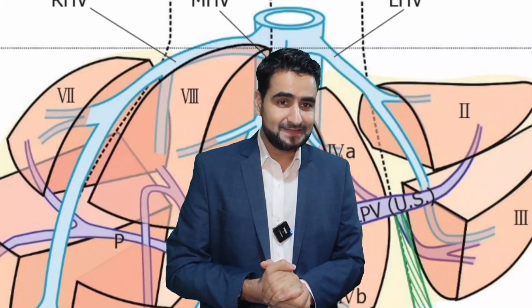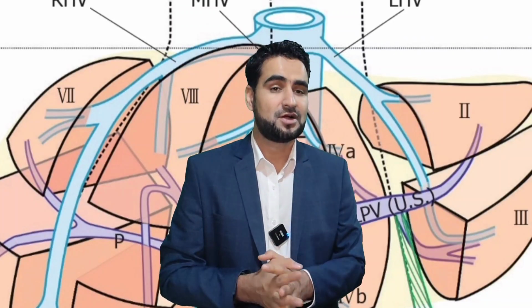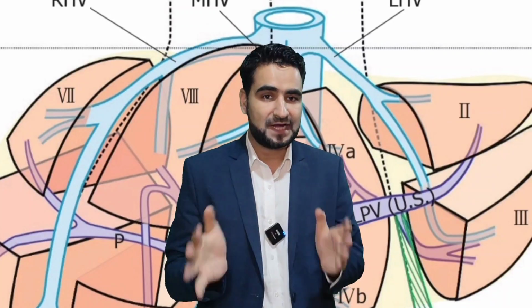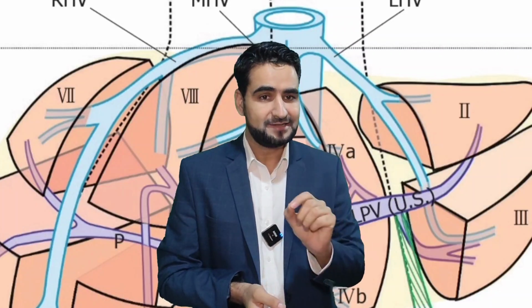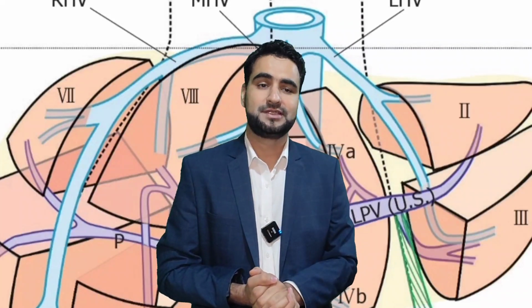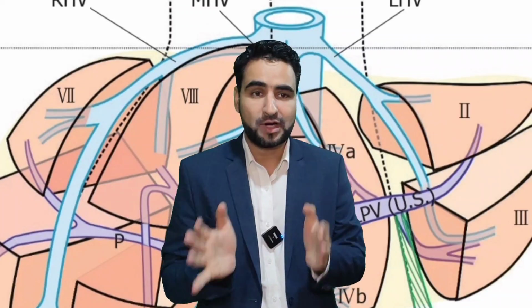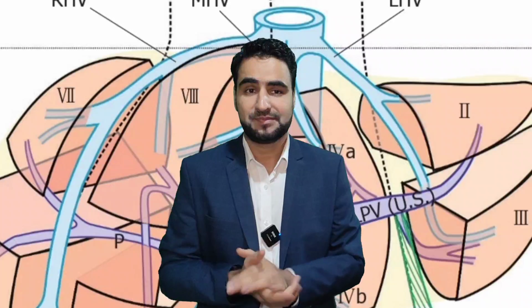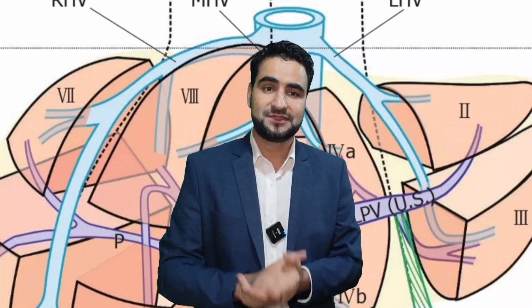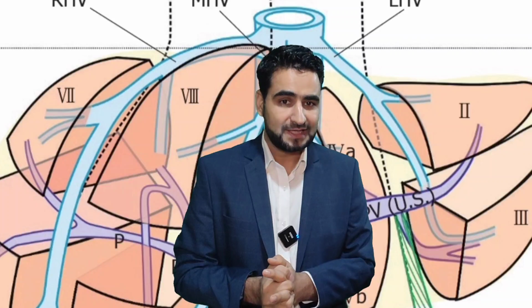Let's summarize the key steps of endoscopic ultrasound imaging from the descending duodenum during a counterclockwise sweep. Start with the inferior vena cava, right kidney, and adrenal gland, establishing retroperitoneal orientation. Then identify the caudate lobe, which points to the transverse part of the left portal vein. Next, visualize the right hepatic vein, which divides the right lobe into segments.